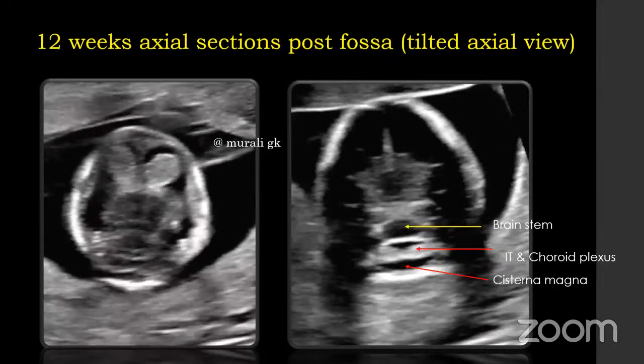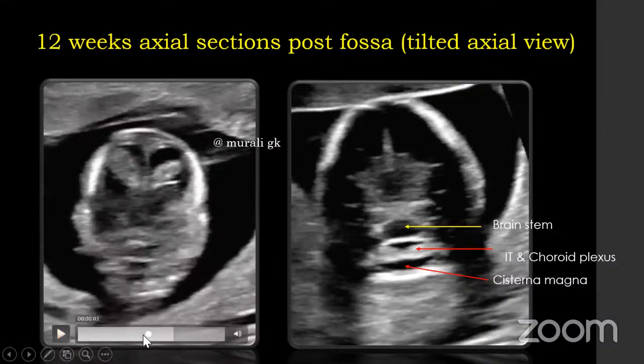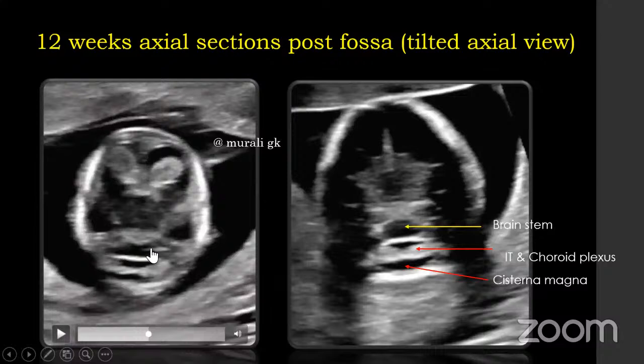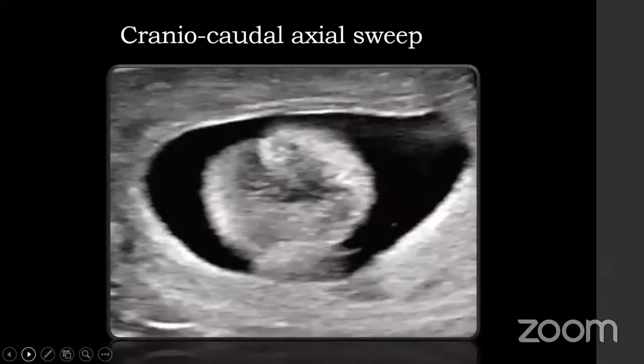So I take a tilted axial view through some angulation, and I get all the anechoic cystic spaces that I see during the NT scan at the level of the axial view with a small tilt. So this I always incorporate in my study for the NT scan. Now from the axial, we move on. Then I have gone through the three major sections.